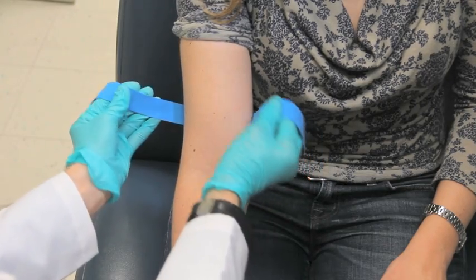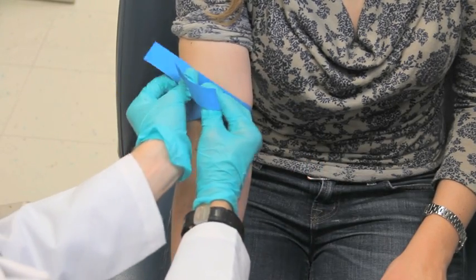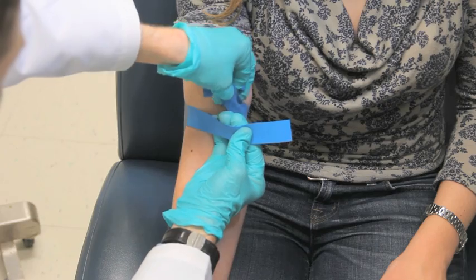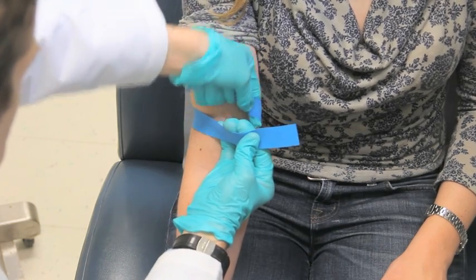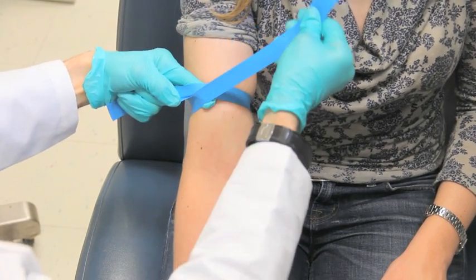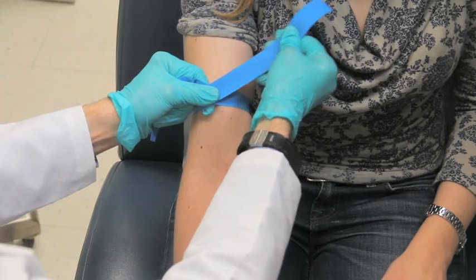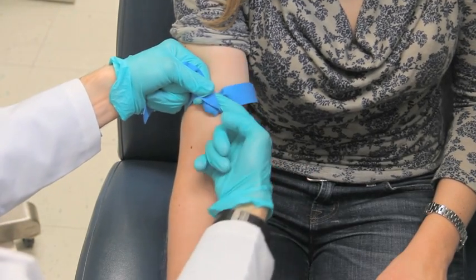First, place the tourniquet under the patient's arm, cross, invert left hand, crawl with left, pull with left, pull with right, pinch the cross point, tuck, release your index fingers.